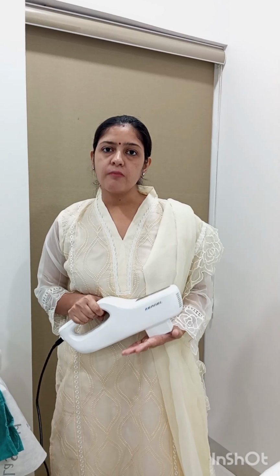So what is minimal erythema dose? Minimal erythema dose is the minimal amount of the UV radiation which is required to induce a perceptible erythema at the site where we have exposed the patient to the UVB, 24 to 48 hours after the irradiation has been done. Okay, so it is the minimal perceptible erythema which develops after the UV exposure in the patient, and it is there for 24 to 48 hours. So this is how we need to first understand what is the minimal erythema dose, and then we need to calculate the minimal erythema dose in the patient.